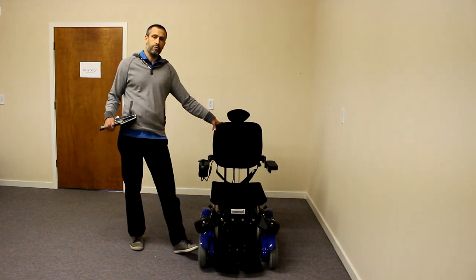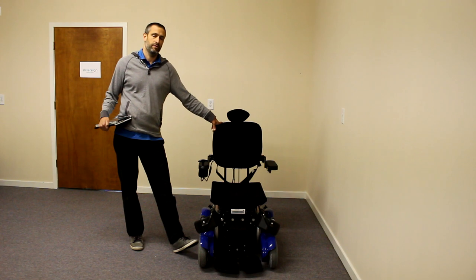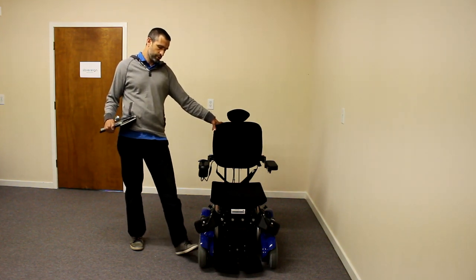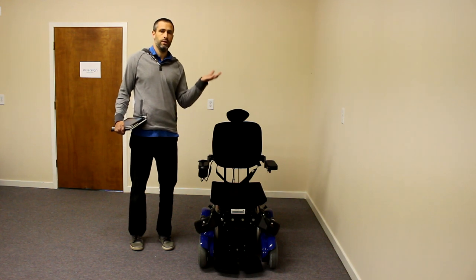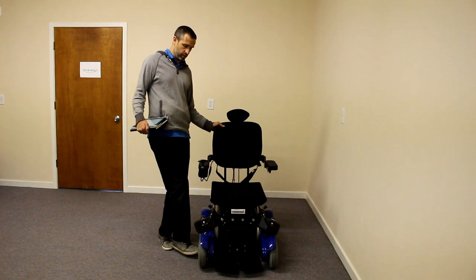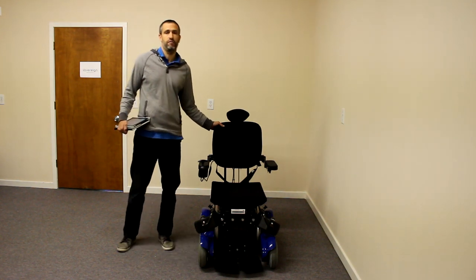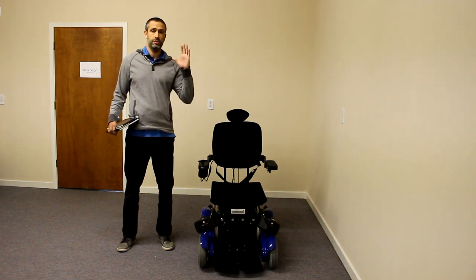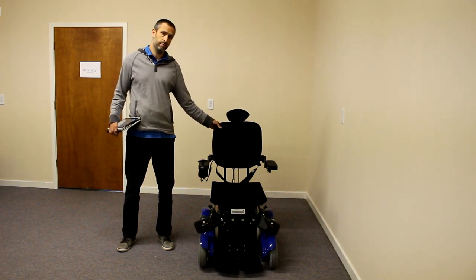The front wheels are powered as well. Some people have called it a four-wheel drive, even though the front wheels are not touching the ground. But when you stand up, the front wheels actually drop to the ground and the mid-wheels are lifted up, and it becomes a front-wheel drive while driving. So front-wheel drive in the standing position, and mid-wheel drive in the seated position.